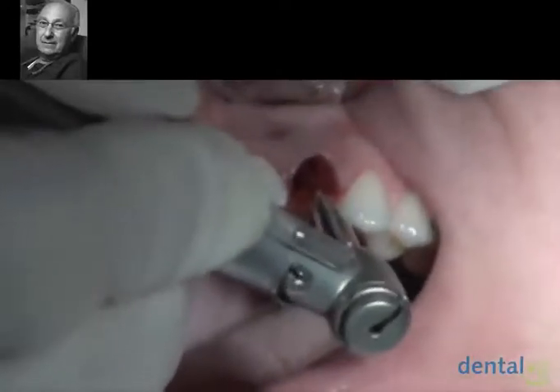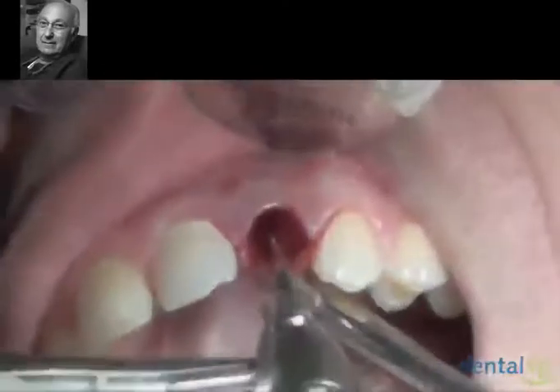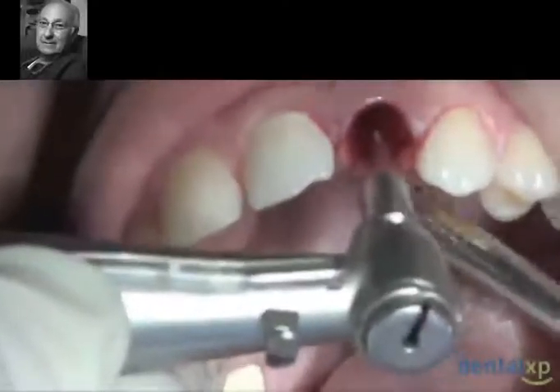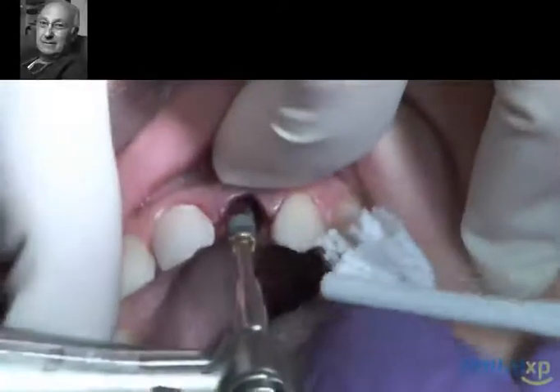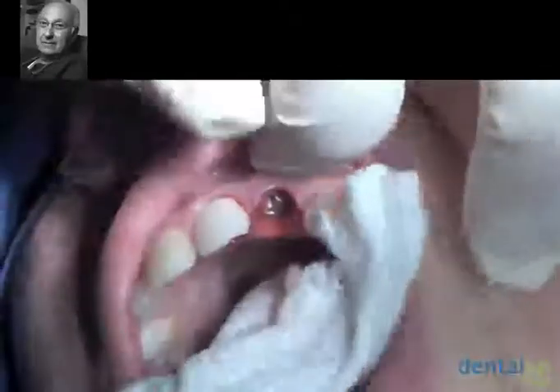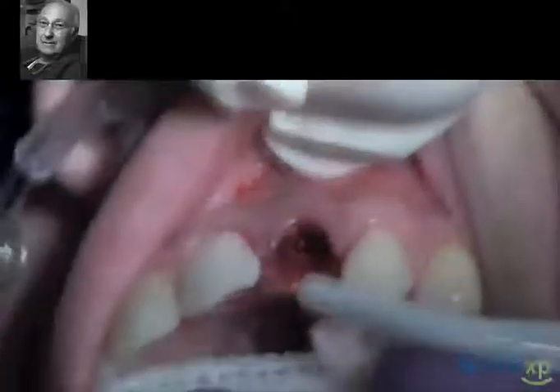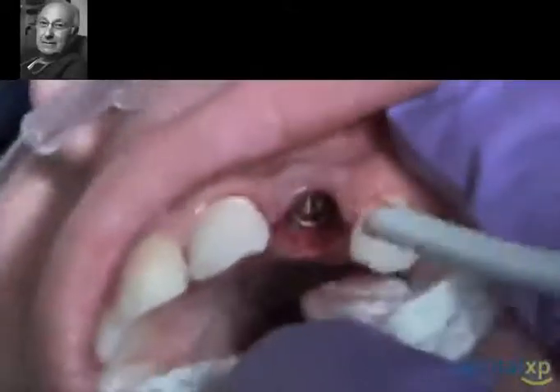We use a surgical precision drill to start our osteotomy, followed by the series of appropriate drills for placement of the 4.0 NEOS dental implant. We will prepare the site using the surgical drills as we mentioned, and then once the implant is in place, we use a hand or torque wrench to make sure that the implant is very stable.